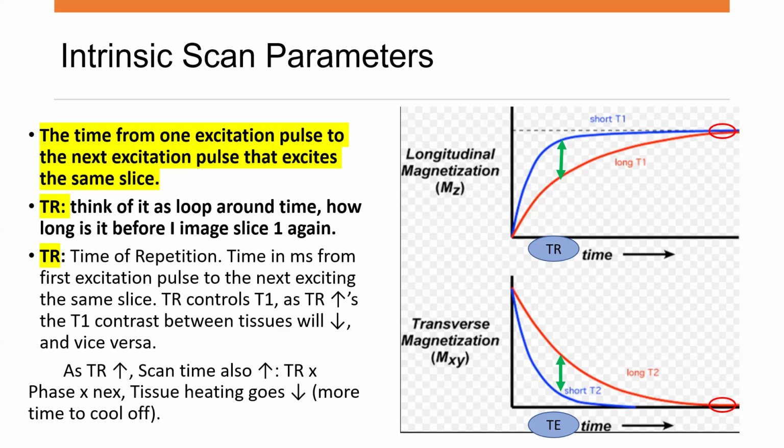If it says you're going to decrease T1, yep. If you increase your TR, you're going to decrease SAR or heating, yep. So you need to know what your factors are. Look at the question, then look at your answers. One of those answers is what they want to hear.